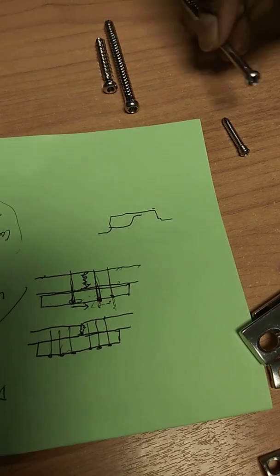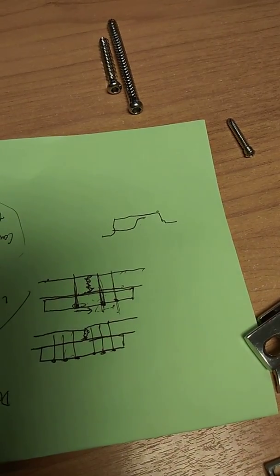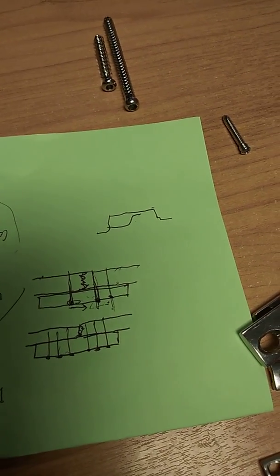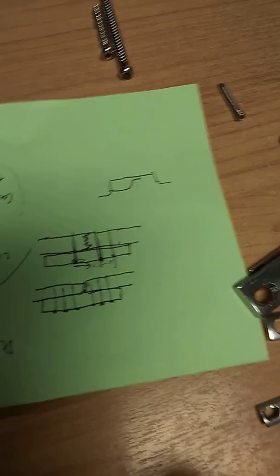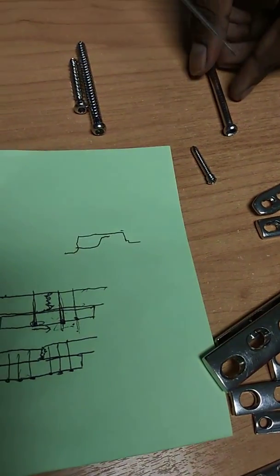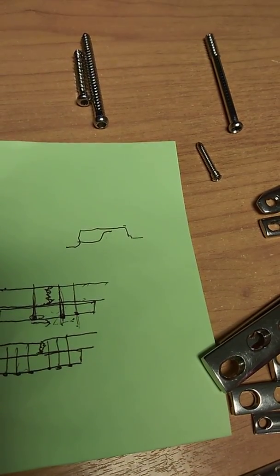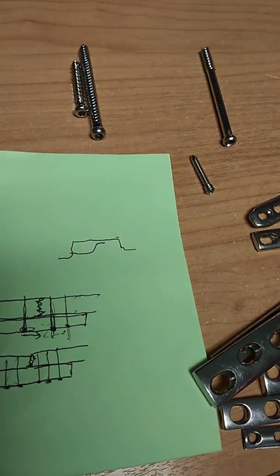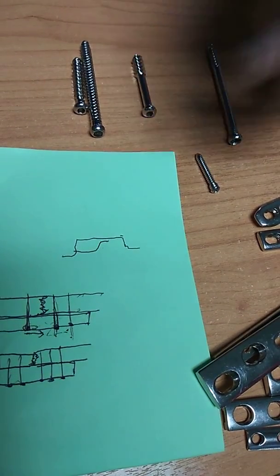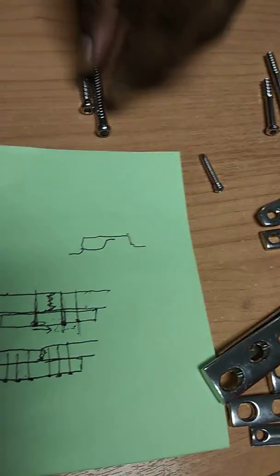That means you can use a guide wire first to hold the fracture and then put the screw inside. And then you fix it with a cannulated screwdriver. Then you take out your guide wire. Okay? And this half-threaded. So you see the main ones.